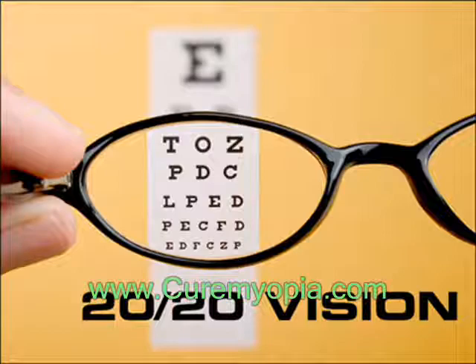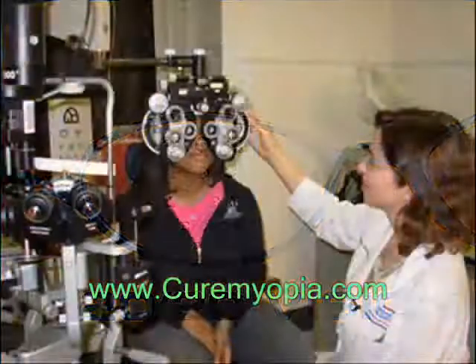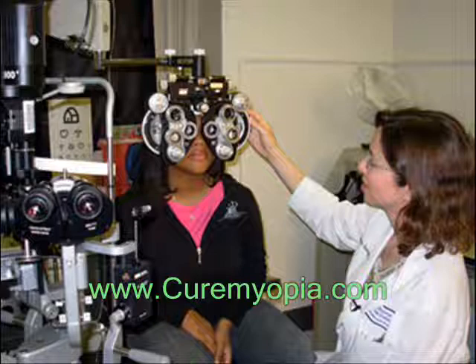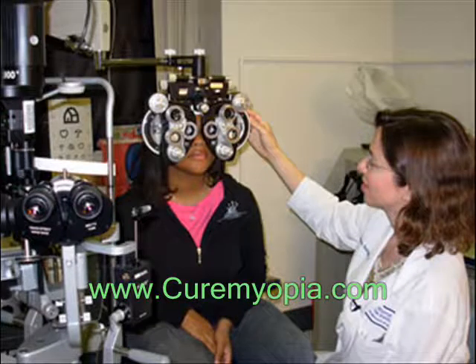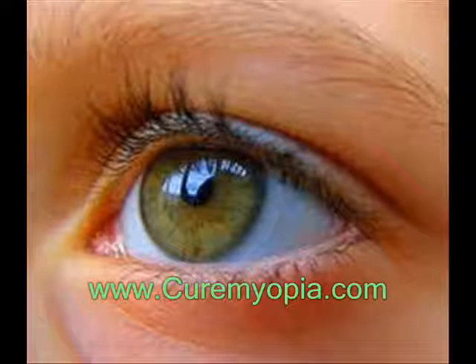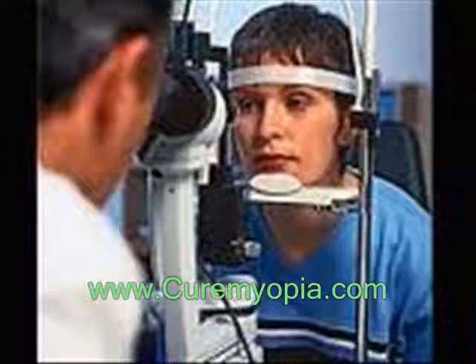A small type size is also used to determine normal near vision. You have a refractive error if you need a combination of lenses to see 20/20. Glasses or contact lenses should give you good vision. If your final vision is less than 20/20 even with lenses, then there is probably another non-optical problem within your eye. The vision level you achieve during the refraction test is called the best corrected visual acuity, or BCVA.